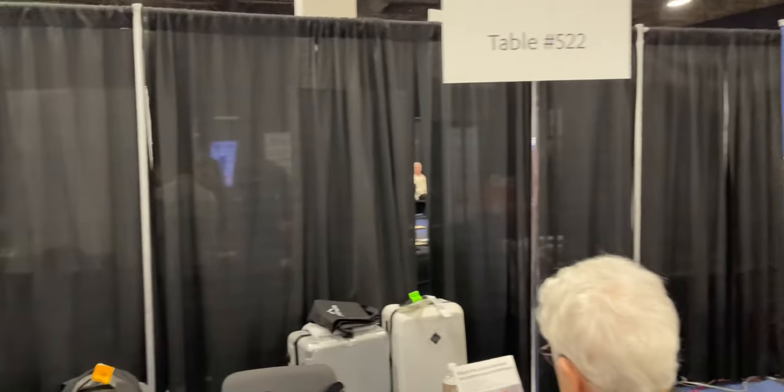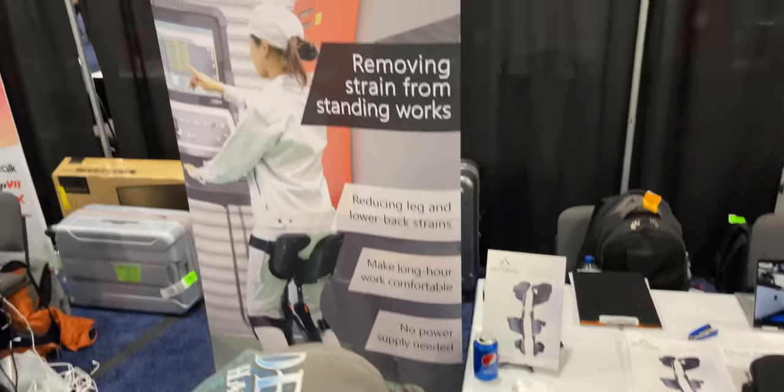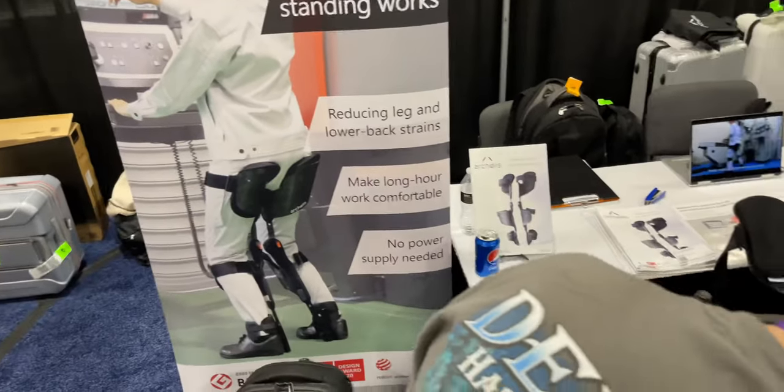Would you like to tell us a little bit about it? What is the target market for this product? This is a product for the standing worker, such as the medical surgeon and industrial factory worker — they have to stand in the same position for a long time.